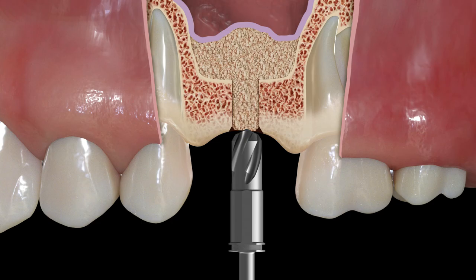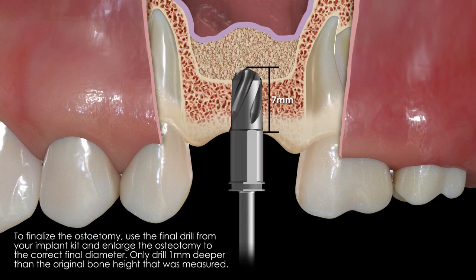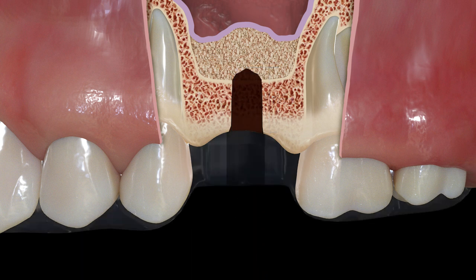There should be a well-contained dome of graft material visible above the sinus floor. Once the desired amount of lift has been achieved, you are now ready to finalize the osteotomy for the implant. Use the final drill for the implant you're placing. It is not necessary to drill to the full length of the implant. Rather, just drill one millimeter deeper than the depth where patency was achieved. With the membrane lifted, you can now place the implant.